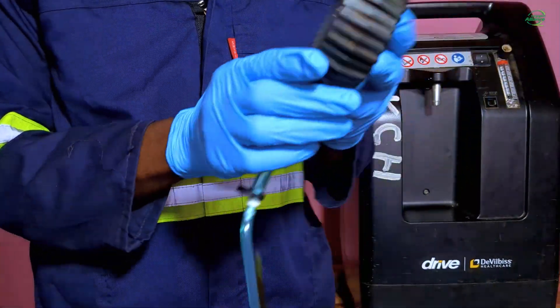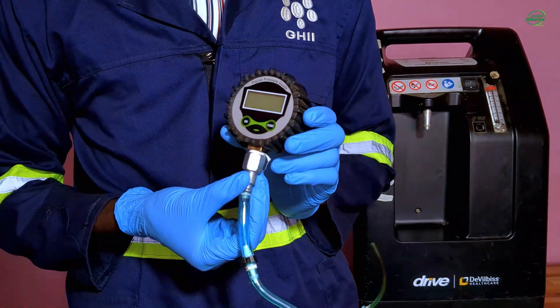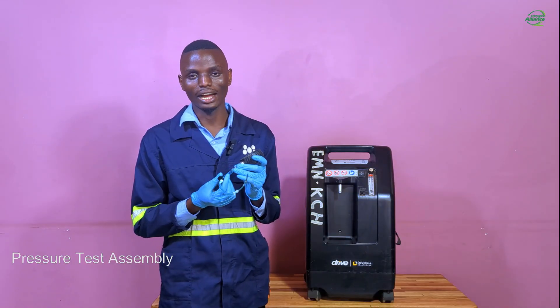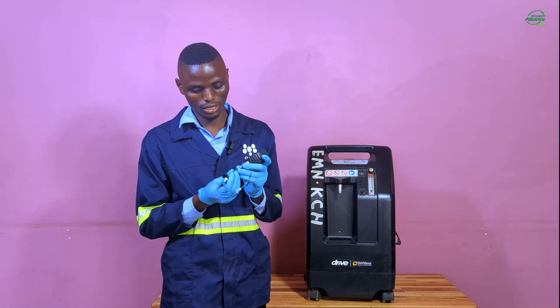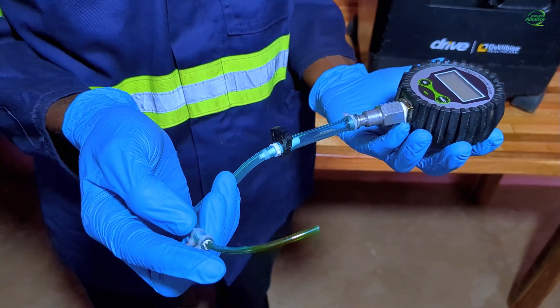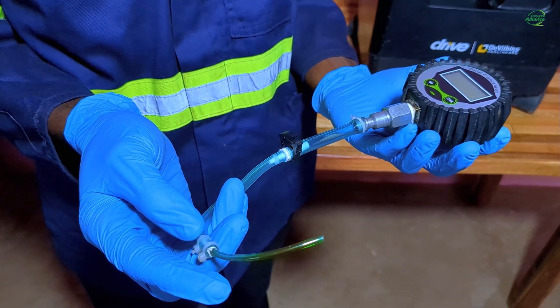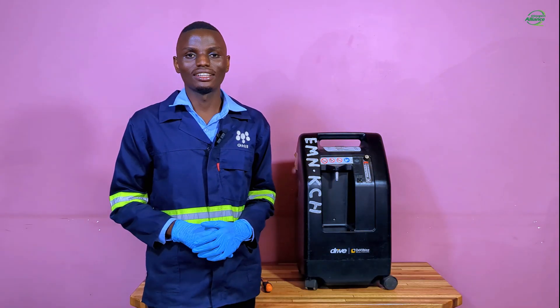You also need a pressure gauge and a pressure test assembly. The pressure test assembly is made up of an adapter and a 1.6 millimeter tubing. In our case, we have used tubings of various sizes reducing to a diameter of 1.6 millimeters so that it can be connected to the testing point.